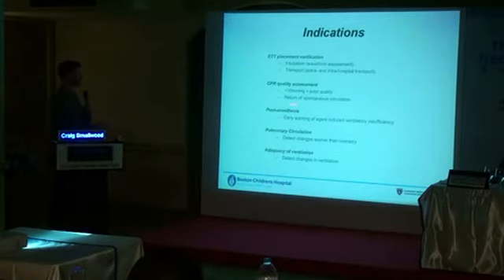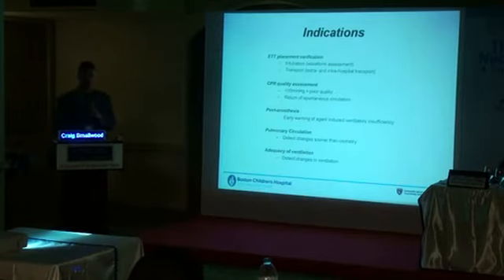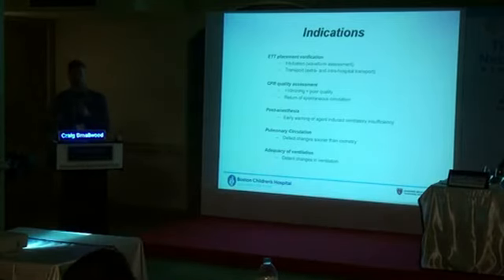Post-anesthesia, you'll see a fair amount in anesthesia recovery units. So post-operation, they'll go to anesthesia recovery, even non-invasive. Folks will oftentimes use a nasal cannula, and I don't have a picture of this, but you've seen the nasal cannula where you aspirate a sample and you can get a capnographic waveform and a value. The values are used a lot less than on an intubated child because you're entraining a lot of room air.